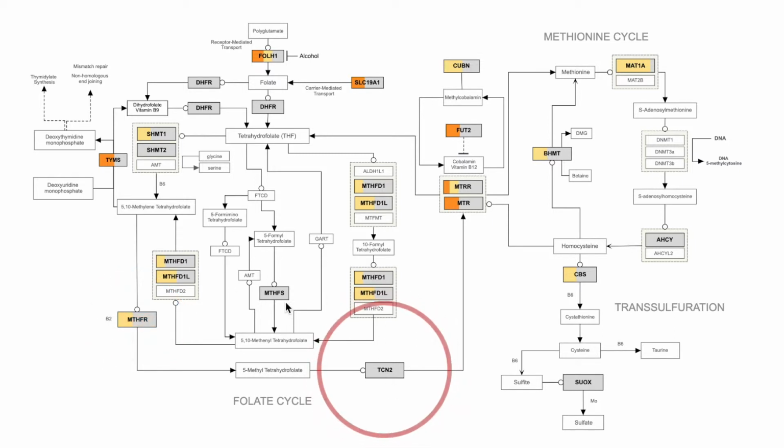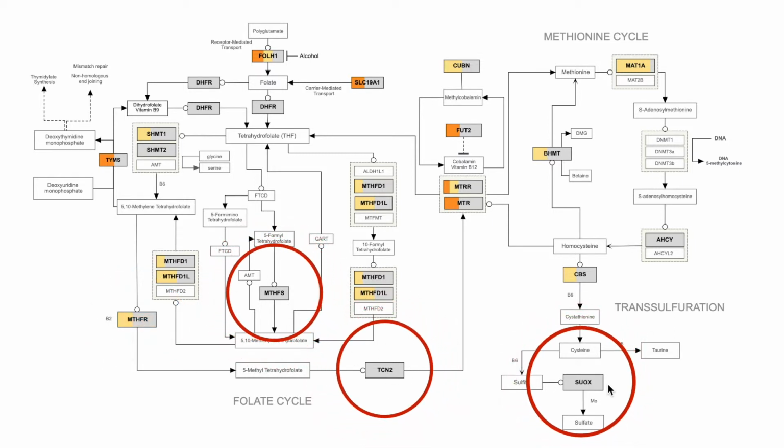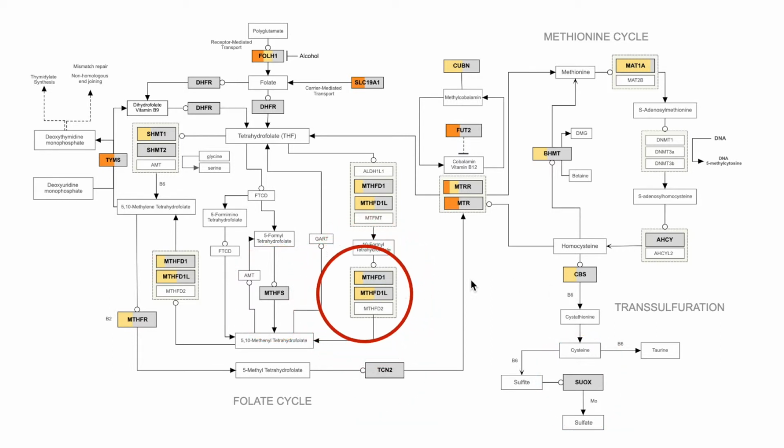We have a lot of these gray squares here, which basically indicate that there is no risk. So the patient does not contain any of the risk alleles there. The yellow would be heterozygous, and the orange would be the homozygous risk. And the farthest that it is filled up tells you how many SNPs are impacted by that. And you can see this one here for MTR, several of them are orange, so homozygous risk, and other SNPs are no risk or have a null allele.